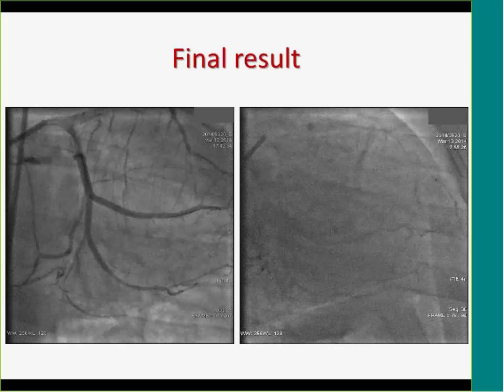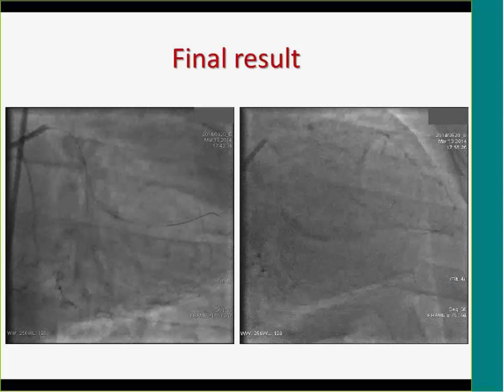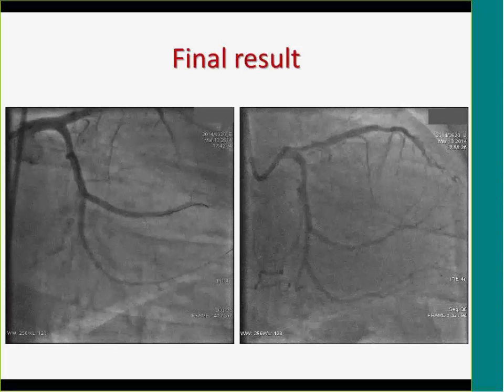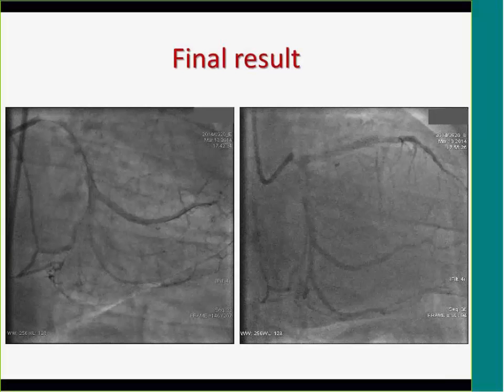As I mentioned, we could not use a trapping balloon in the same guiding catheter, and I did not dare to change the Confianza to another wire.